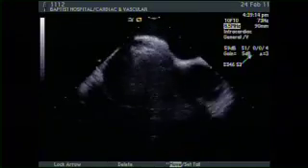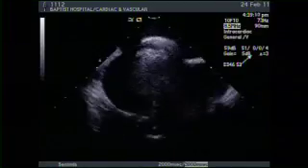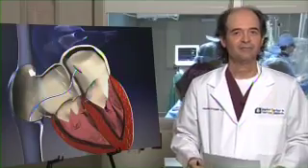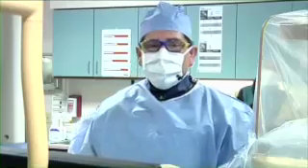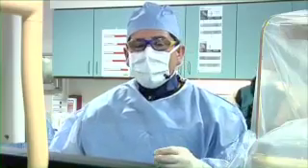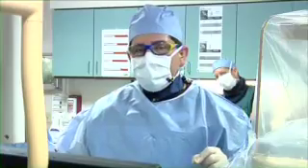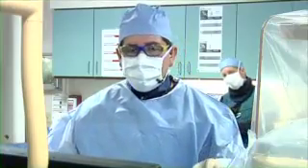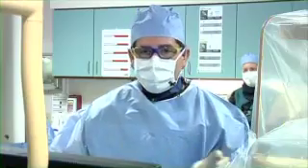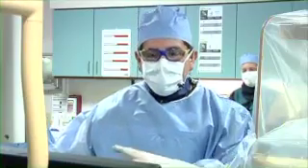You know, Ramon, while you're getting that ready, here's a question. Does this procedure carry a risk of stroke itself? Absolutely. There's no question about it. We are having catheters inside the heart, and you can form clots on both sides of the device. And that's why these patients are on blood thinners. We put them on heparin. Heparin is an intravenous blood thinner through the device, and we test the blood to make sure that the patient is well anticoagulated through the procedure.